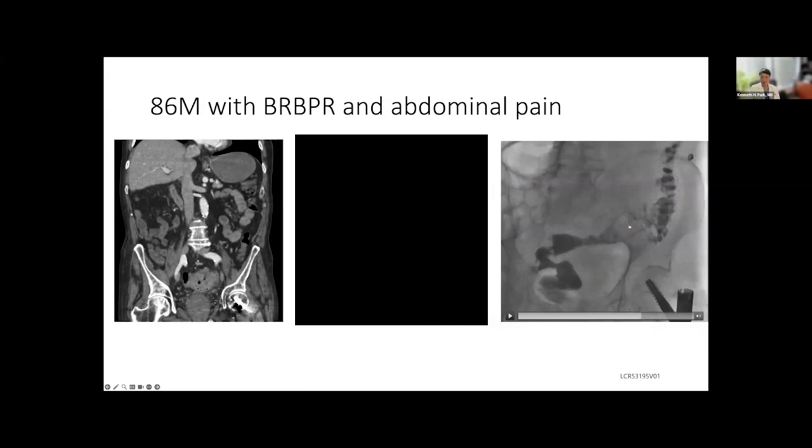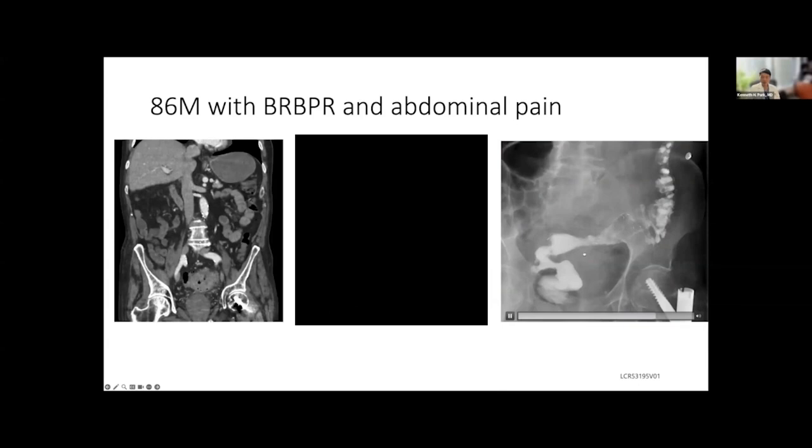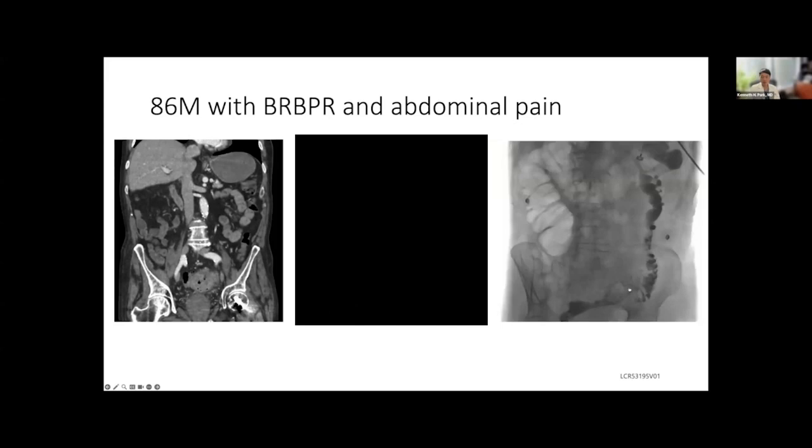And this is the final product. Because of the gold beads, you can clearly see where the middle of the stent sits, and it's sitting right at the center of the stricture. Maybe a little bit off, but pretty good otherwise. Everything went pretty well. And so when we do a final shot, the stent is in a good place in the sigmoid colon.